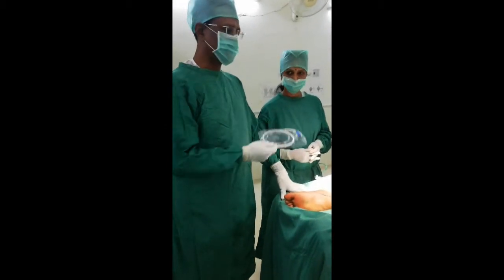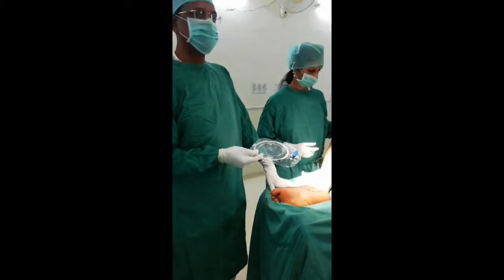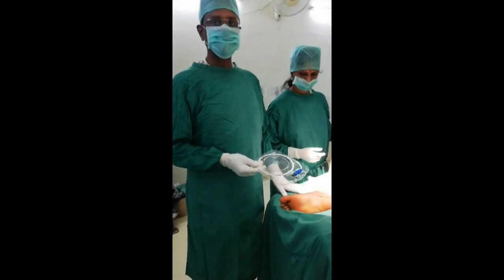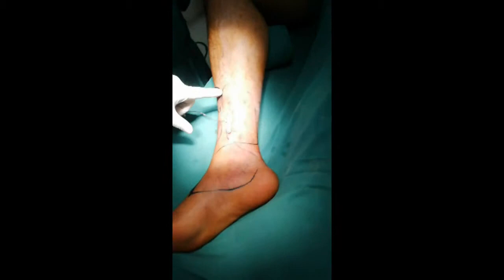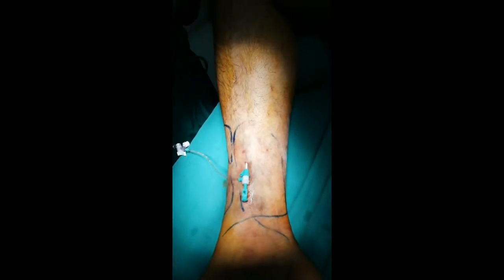She is Dr. Mallory. Mr. Javid Fahim is a 28-year-old having varicose veins of grade 4 in his right lower limb. We can see the varicose veins here marked out, and also the skin changes which have happened because of chronic venous stasis. He is quite tall, so obviously he has got longer venous pressures.